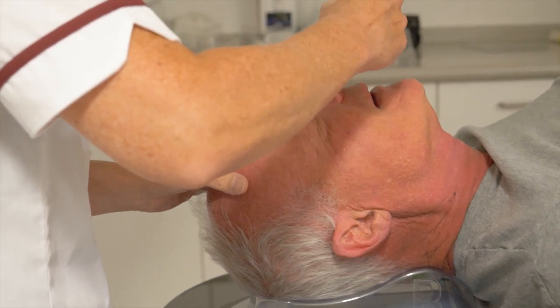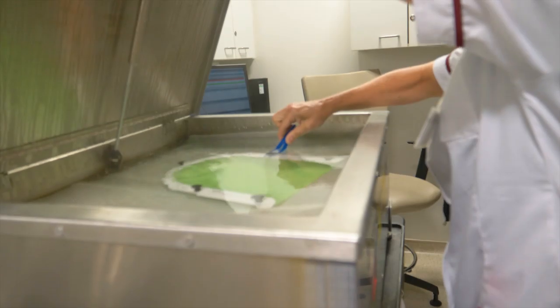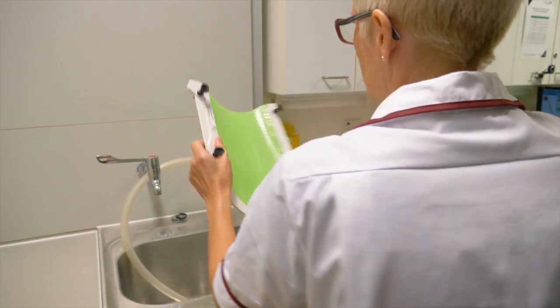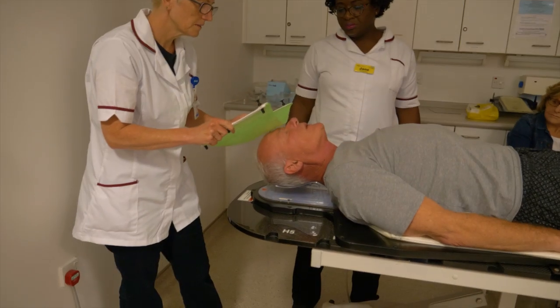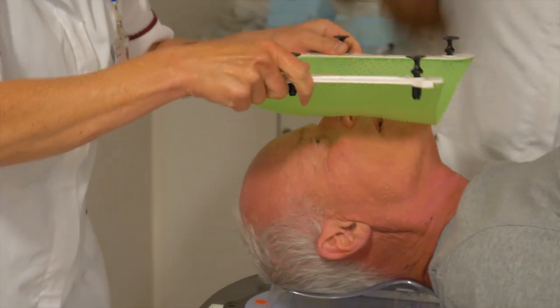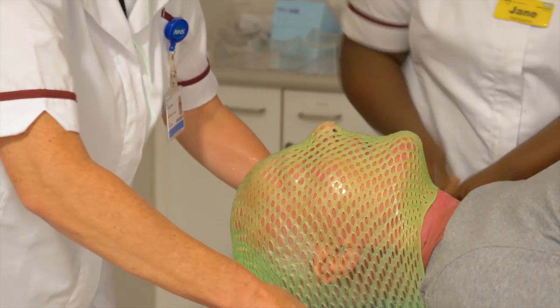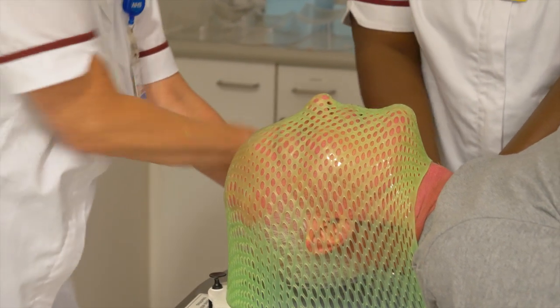To get the shell fitted, the patient will usually be lying on a couch on a neck rest. The plastic will be warmed up to a certain temperature so it's nice and soft and can fit to the patient's face. It's not too hot, and you can see it being put on the patient's face so that they can feel exactly how warm it is before it goes right over. The mask is going to be a tight fit but it shouldn't be uncomfortable, and you can definitely breathe through it through lots of small holes. Despite this, some patients can find it quite claustrophobic.